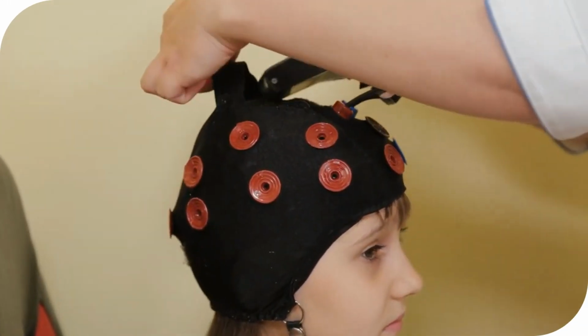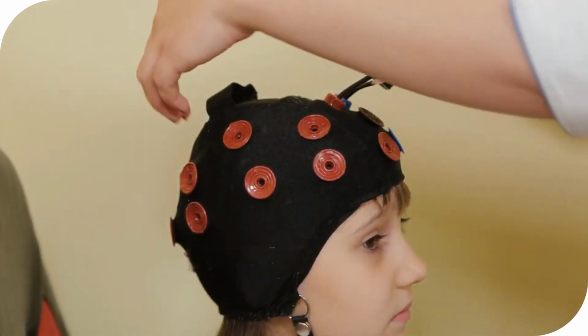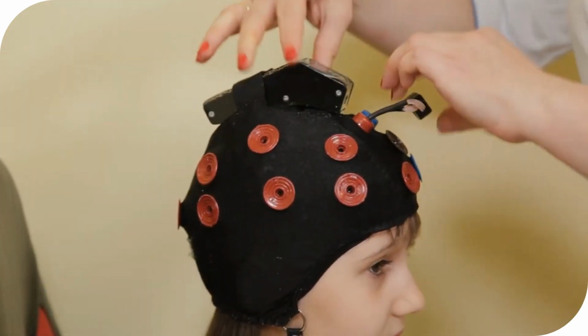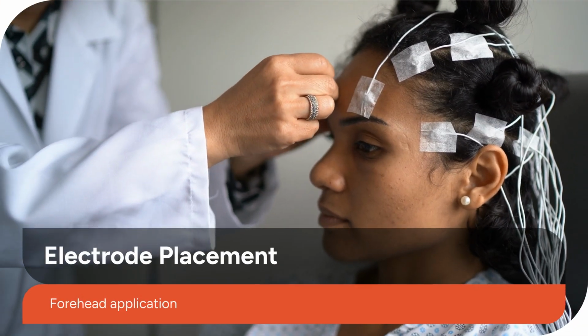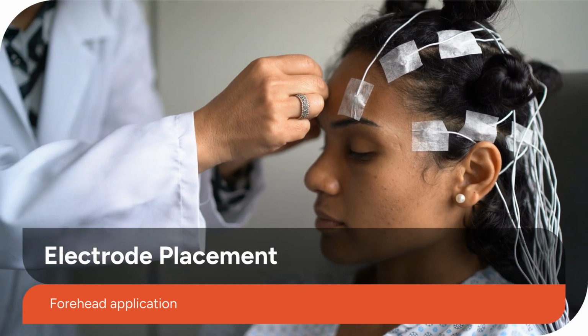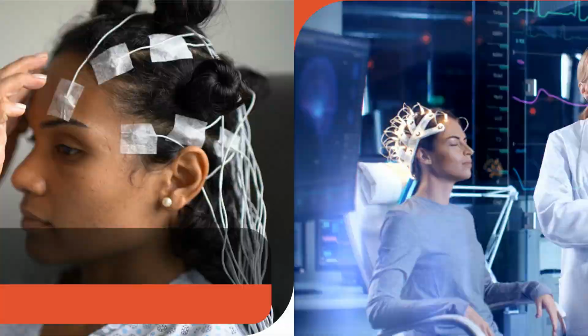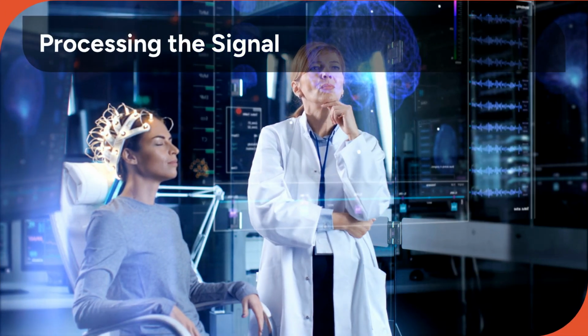The core technology used is electroencephalography, or EEG. This non-invasive method reads the tiny electrical impulses generated by the brain's neural activity. Small, disposable electrodes are strategically placed on the patient's forehead to capture these brainwaves, similar to how an ECG captures heart rhythm. Once captured, the raw EEG signals are complex and require advanced processing.